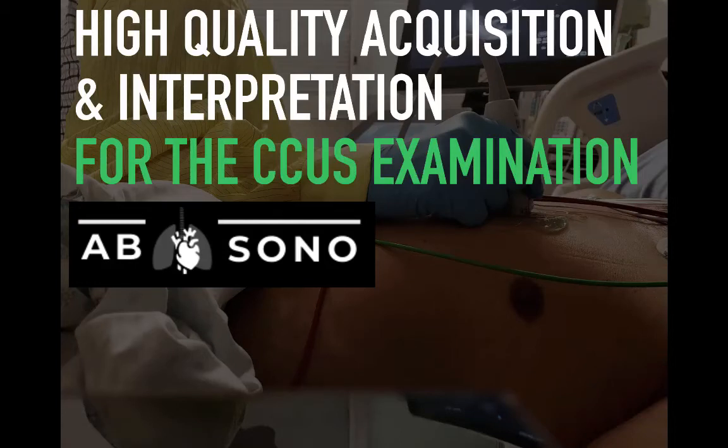Welcome, this is Dr. Brian Buchanan from the Department of Critical Care Medicine. We'll talk about high-quality acquisition interpretation for the critical care ultrasound examination.